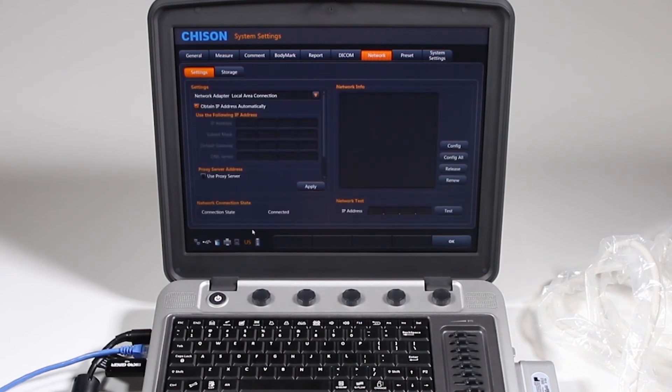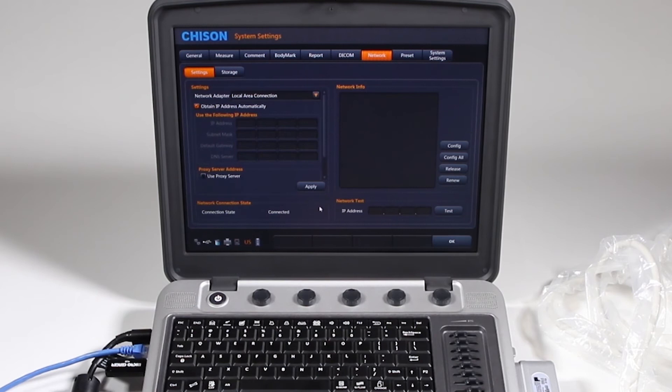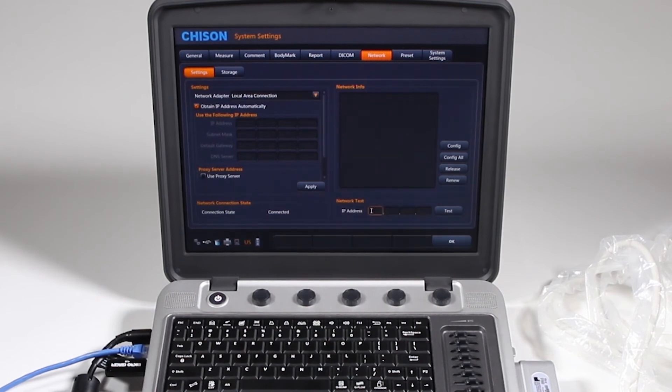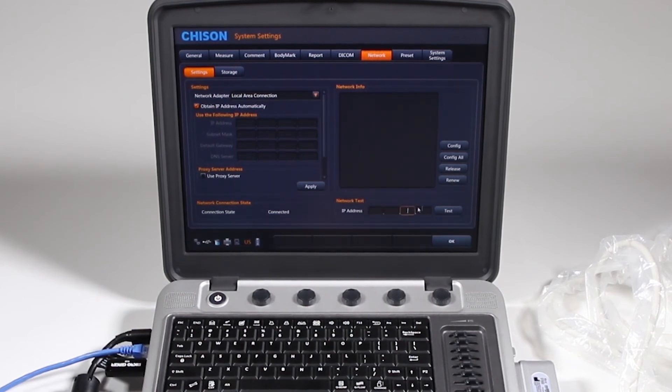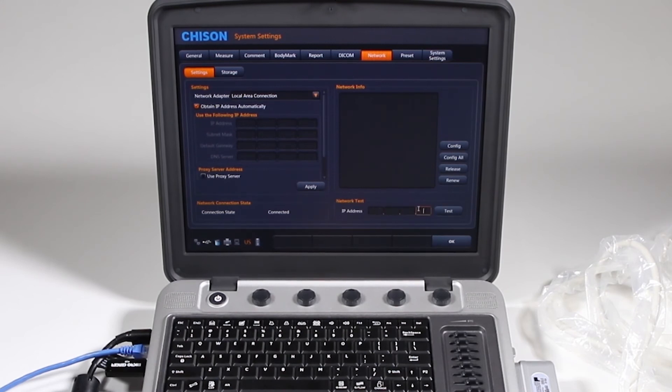When you do this, it'll say connected or it won't say connected once you get it all figured out. You can also ask your IT department to give you a test IP address. It's also called ping, so they would give you that to ping.